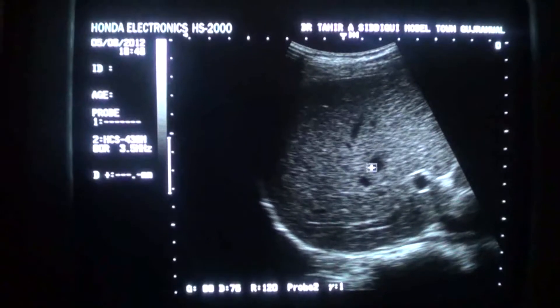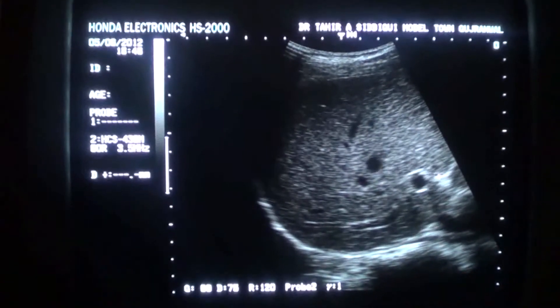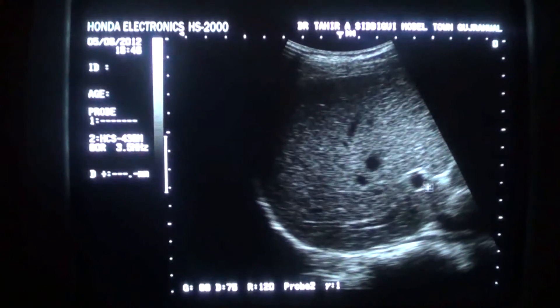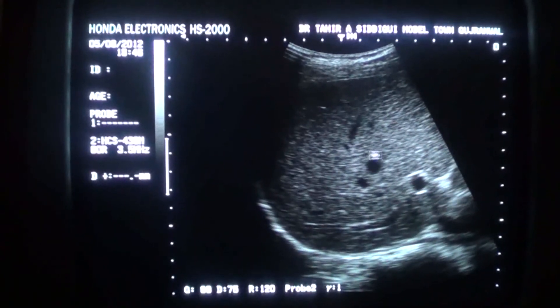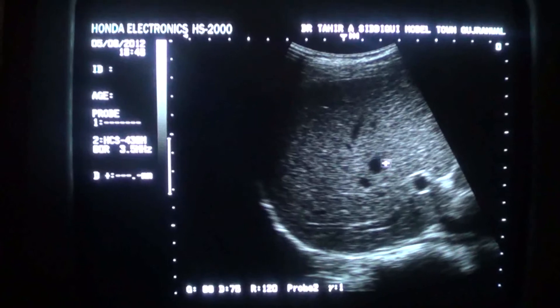This is the hepatic vein. This is the portal vein radicle because it has echogenic borders, and this is the hepatic vein because it has no echogenic borders.